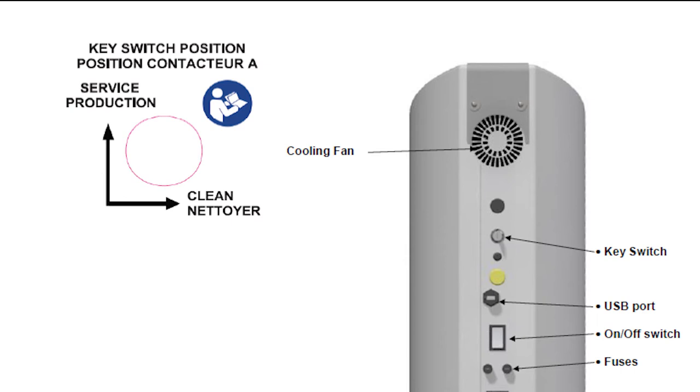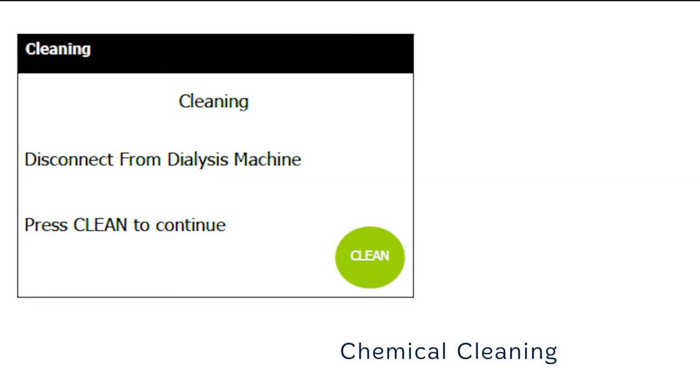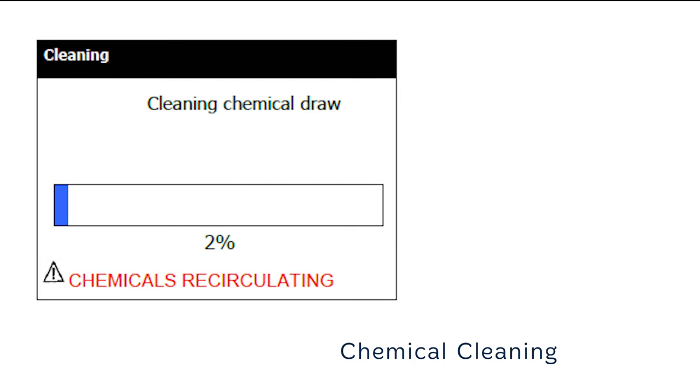If you select no, you will return to the power on screen. The unit will automatically adjust the level of water in its internal tank before the chemical cleaning agent is added. This will only take a few seconds and automatically proceed to the next stage. Now disconnect the external water loop from the inlet of the dialysis machine to ensure that no chemicals can be fed into the dialysis machine. Press clean to continue. Once the cleaning solution is made, place the 4 mm tubing connected to the acid port at the rear of the unit into the bottle, making sure the tube goes all the way down to the bottom. Press clean to continue. The chemical in the bottle will now be sucked into the unit, which should only take about 30 to 60 seconds.